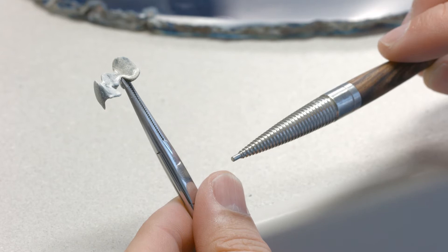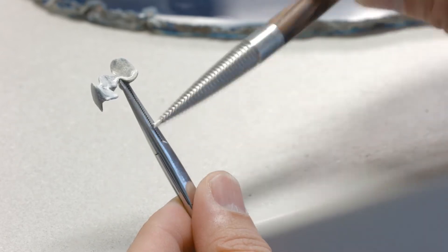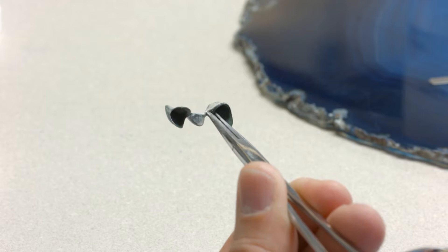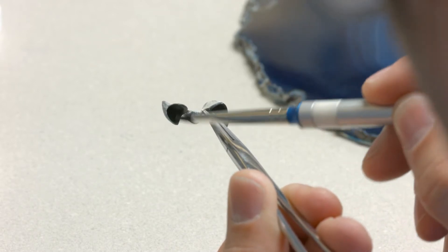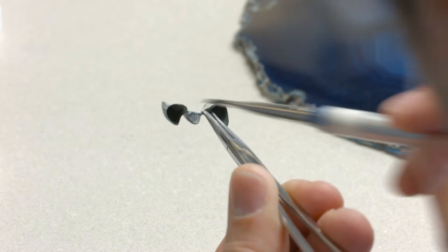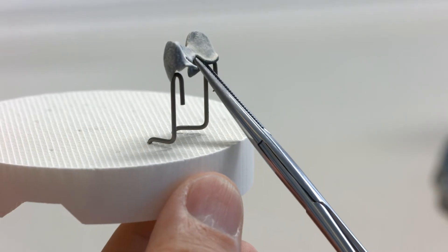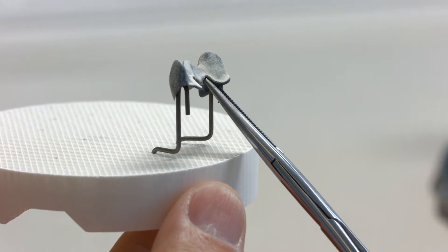This will help to achieve a sound bonding layer between the metal and all the following ceramic layers. It's important to ensure that excess opaquer does not reach the inner aspects of crowns since this may lead to inaccuracies of fit.